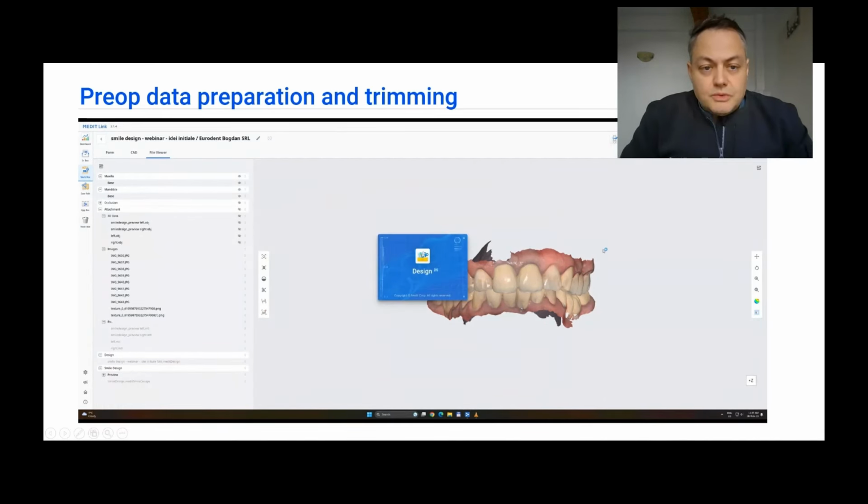Just to explain one more time what we did before. First we are cutting the teeth out and generating a model with virtual extraction sites, because the wax up that we are generating is going to get merged to this model, and we are going to use Boolean functions to do this Boolean merge. This function only works well when the two models intersect. So this is why we are going to use the model with deeper pockets.